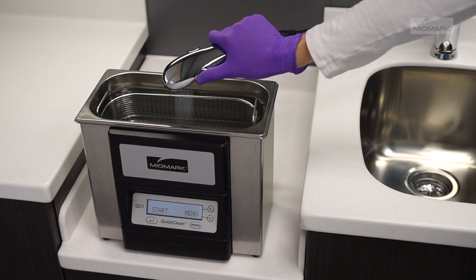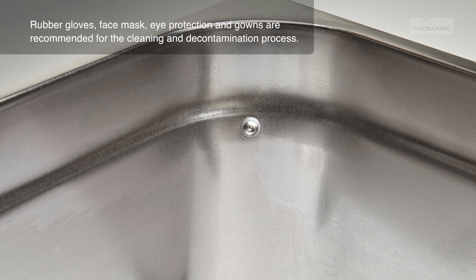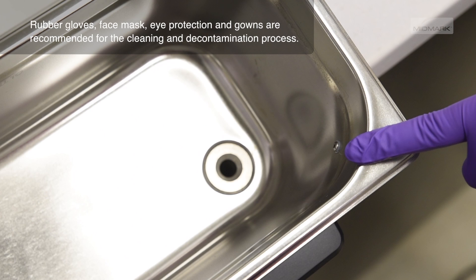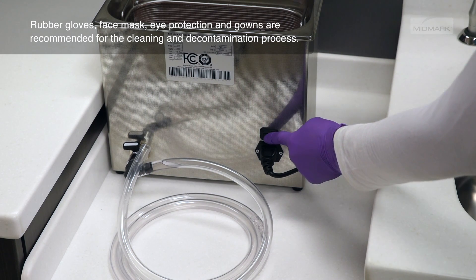Before operating your Quick Clean ultrasonic unit, pour cold water into the tank to the fill-to line. This will submerge the water level sensor located in the front corner of the tank and allow the unit to safely operate. Add the required dose of cleaning solution and turn on the machine using the switch at the rear of the unit.